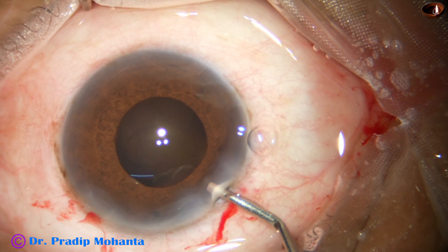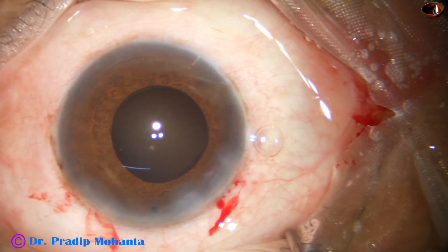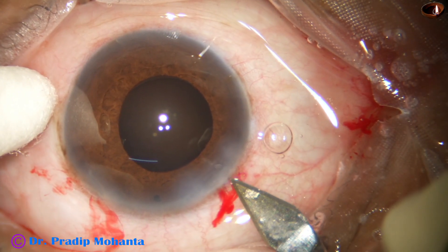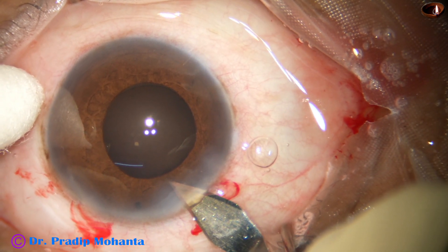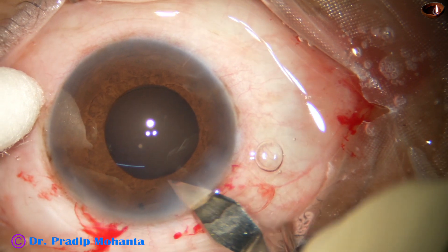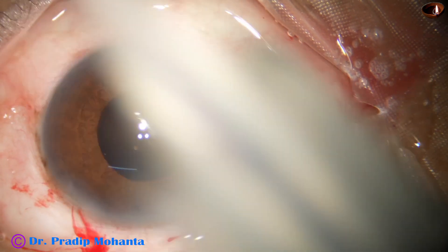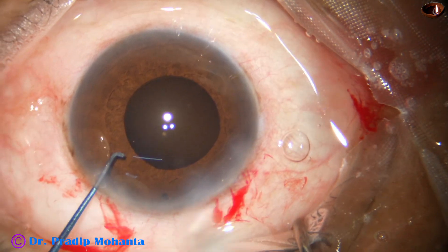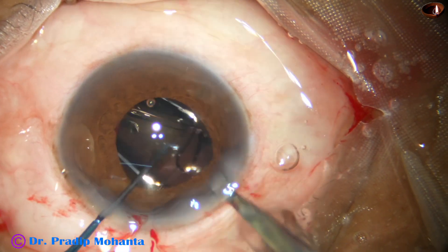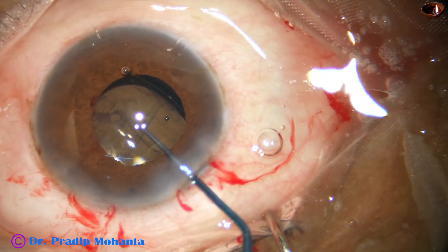Now I take help of visco to implant the intraocular lens. I am using a big cartridge, so I am enlarging the main wound by just 0.1 mm. Now, how to enlarge and gauge the wound — it should not be tilted toward the cornea. Rather, tilt it toward the sclera a bit and you will get an extension toward the sclera. And here goes the intraocular lens. Hope it has gone into the capsular bag — I say hope because we don't know; we can't see the capsule margin.